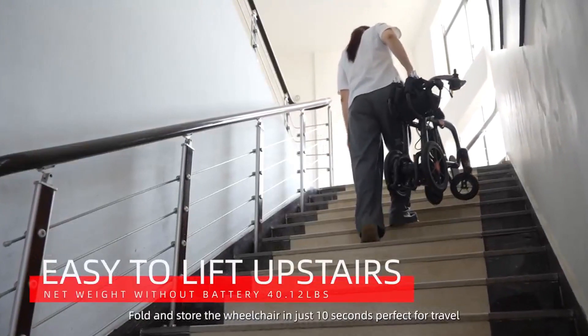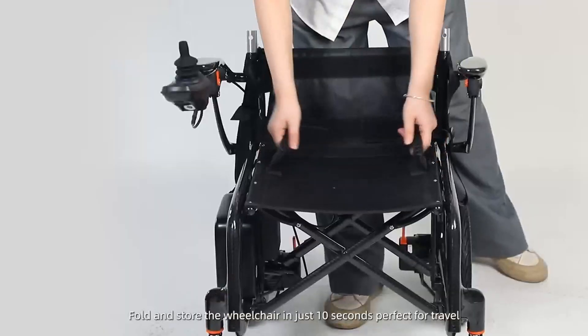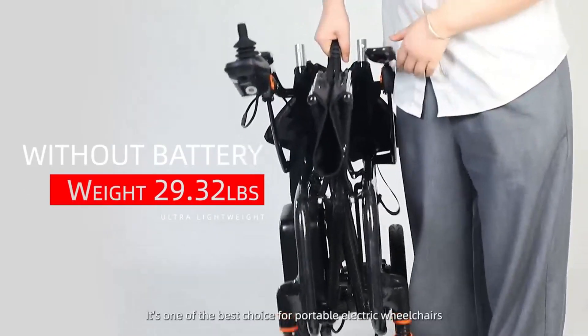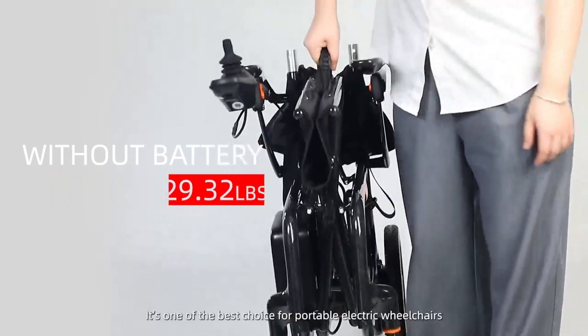Fold and store the wheelchair in just 10 seconds, perfect for travel. Ultra lightweight at only 29.32 pounds without batteries, making it one of the best choices for a portable electric wheelchair.